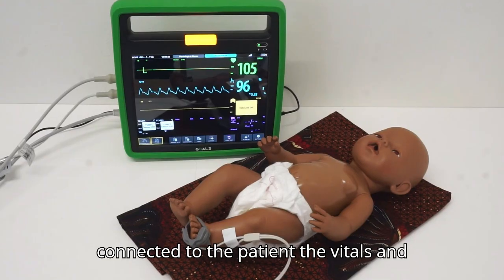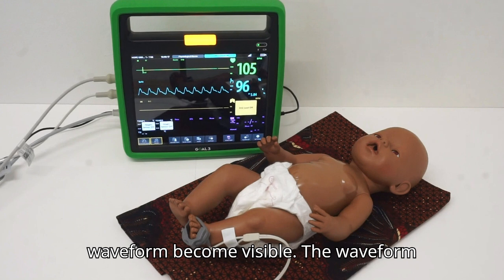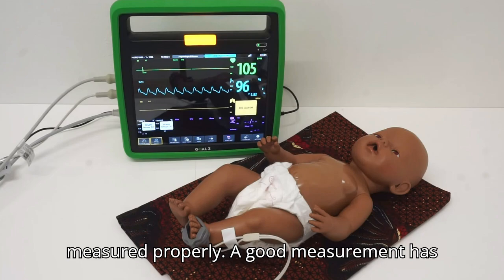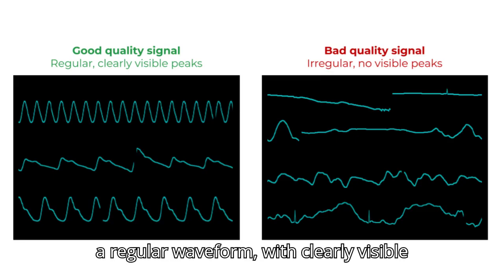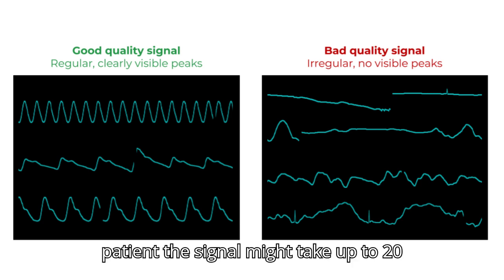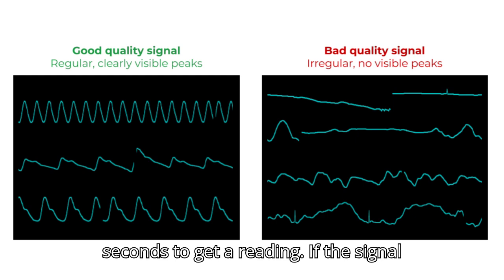When the probe is connected to the patient, the vitals and waveform become visible. The waveform could help to see if the vitals are measured properly. A good measurement has a regular waveform, with clearly visible peaks. When placing the probe on the patient, the signal might take up to 20 seconds to get a reading.